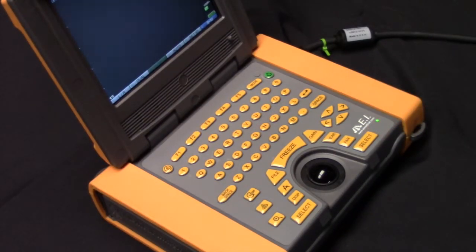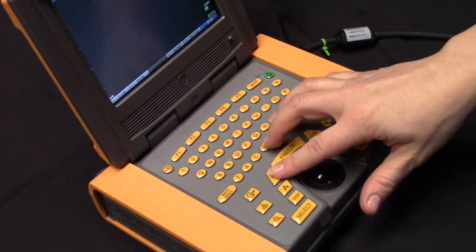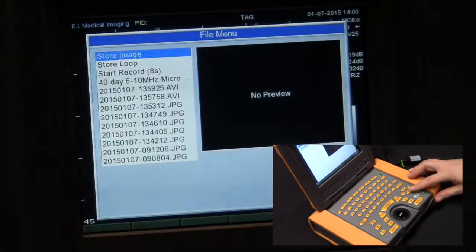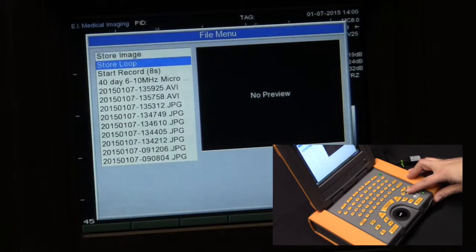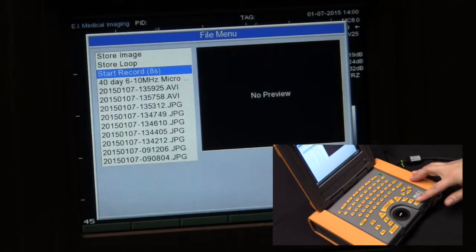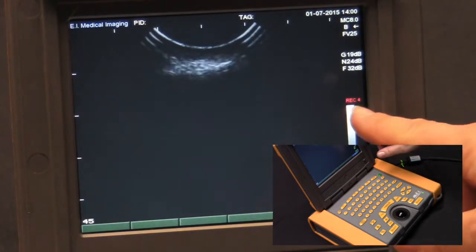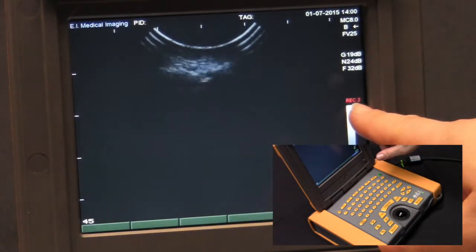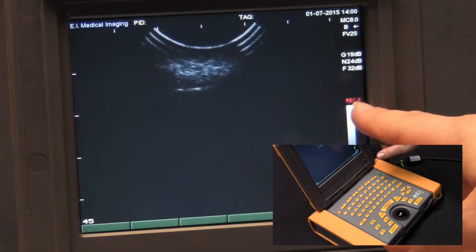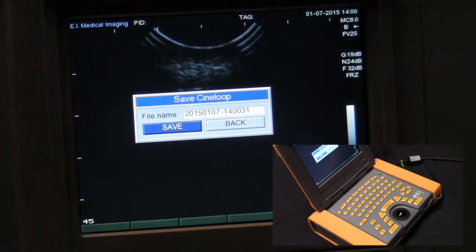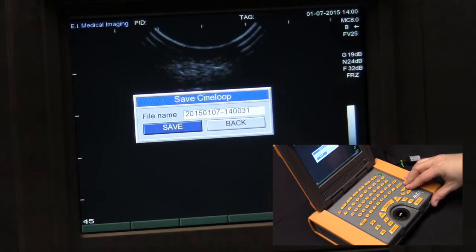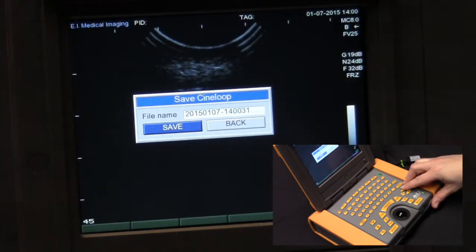To record forward in time on your IBEX ultrasound, press the file key while live scanning. Use your arrow key to scroll down to start record, and press select. The IBEX will begin to record as you're scanning. On the right hand side, you'll see an REC and a number highlighted in red. This indicates that the file is being saved. Your save Cineloop menu will come up at the end of that time.